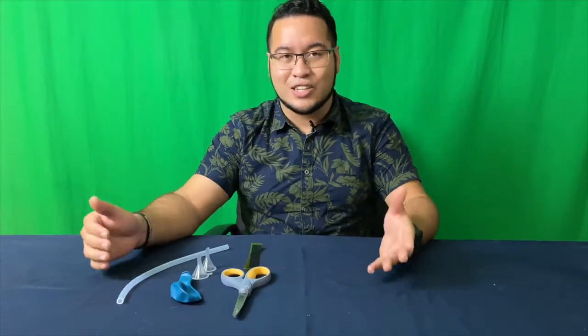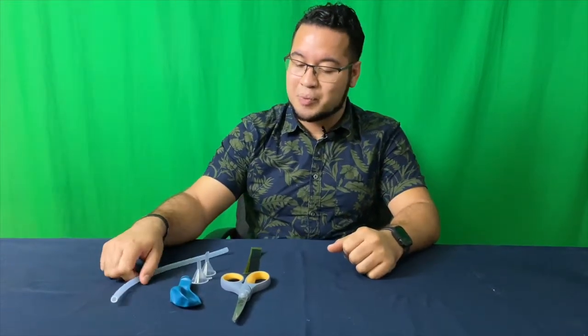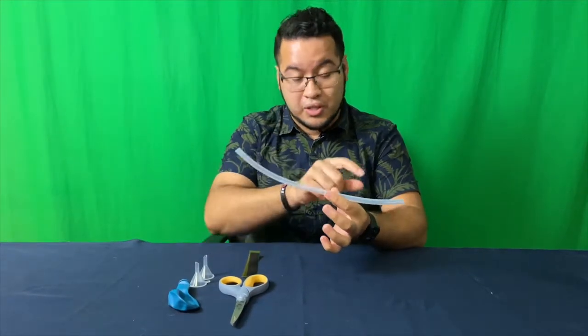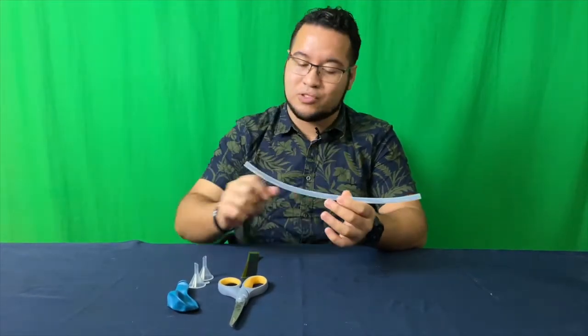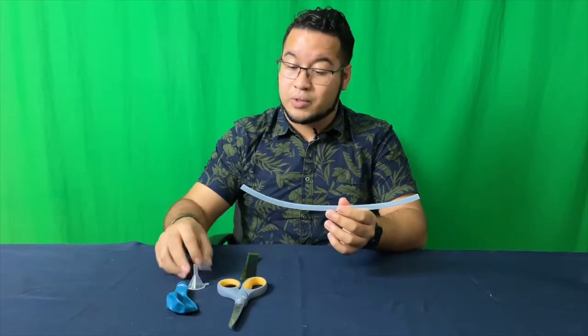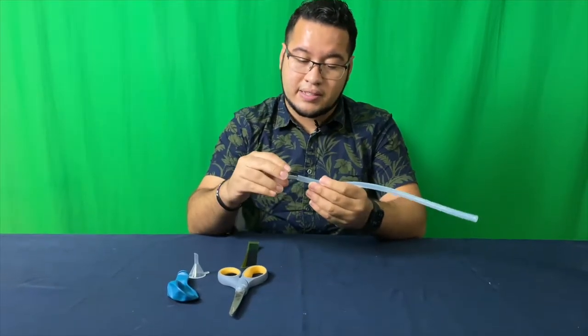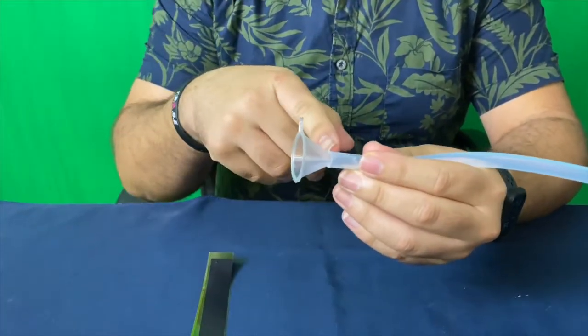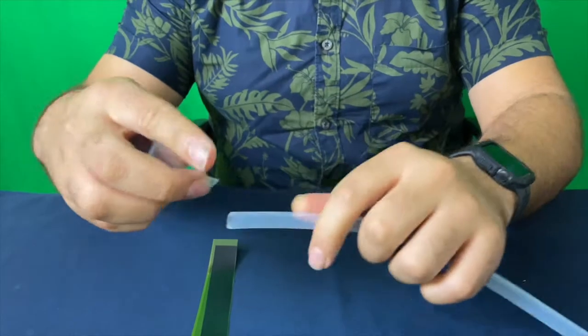Now that we have our supplies, let's go ahead and start assembling our stethoscope. The first thing you want to grab is this silicone tube. This is going to be the tube that the sound of the heartbeat is going to travel through. What we're going to do is take these funnels and place them inside of both ends. You just want to make sure you push them in there all the way so it's nice and secure.